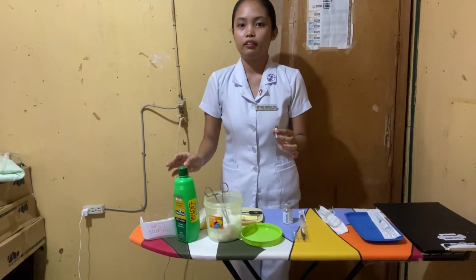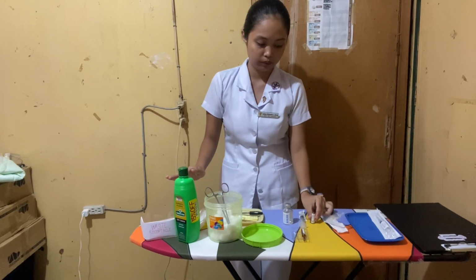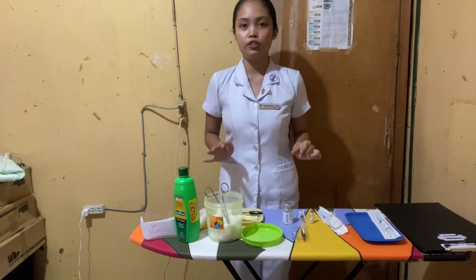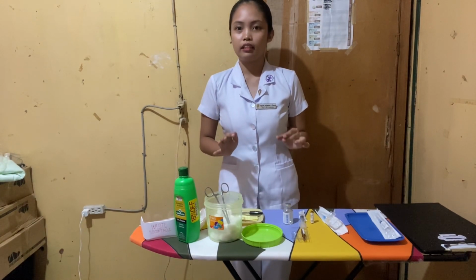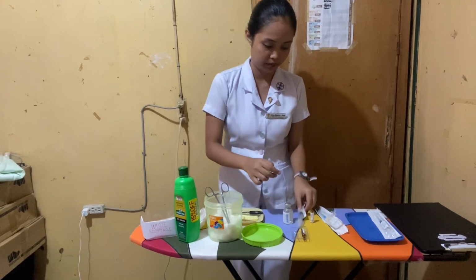After doing that, discard the broken neck of the ampule, set it down, then we're going to get our syringe, then draw out the medication.